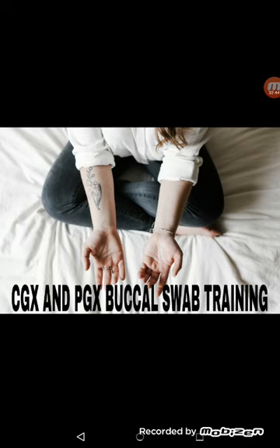With those swabs and samples, at that point, you're going to put it in the UPS laboratory marked envelope that you received, and you will send those off to the lab. Make sure that the swab has the patient's name and also the patient's date of birth. The slip inside the bag should also have the patient's name and the patient's date of birth. Please make sure that these match and that you are doing that.